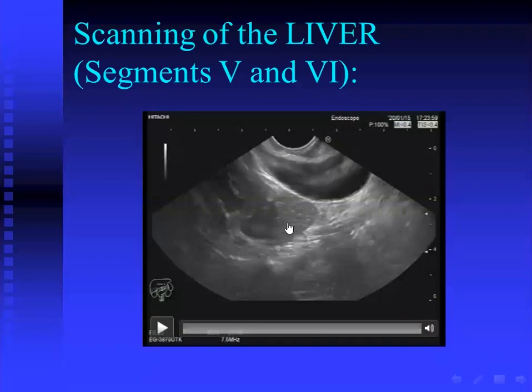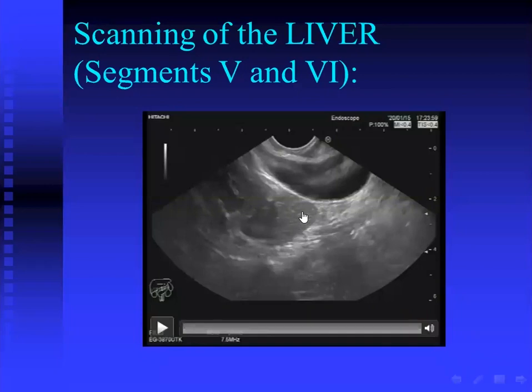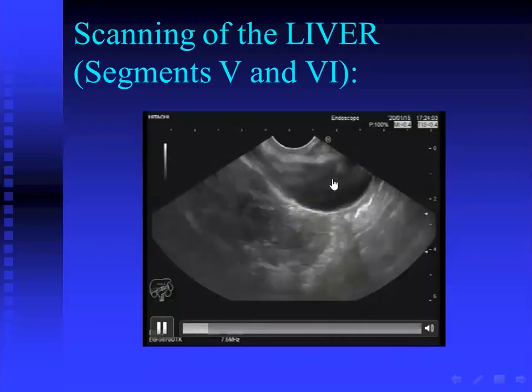The nicest views of the gallbladder are at the bulb of the duodenum, with anti-clockwise rotation of the tip of the echo endoscope to face 9 o'clock, to face the anterior wall of the bulb. Or in the antrum, just before the pyloric ring, in the pre-pyloric area, also looking to 9 o'clock by doing anti-clockwise rotation. Here or there, I can find the gallbladder and the liver. So, nicely seen, this is the gallbladder, seen from the bulb of the duodenum, and this is the liver tissue.